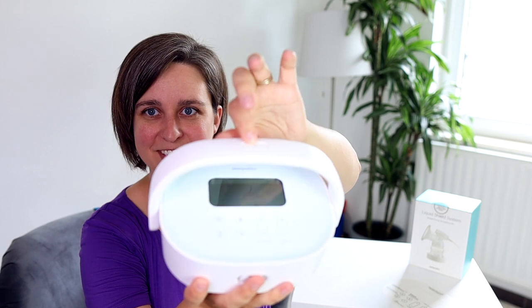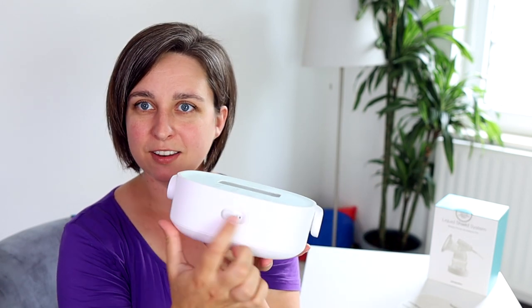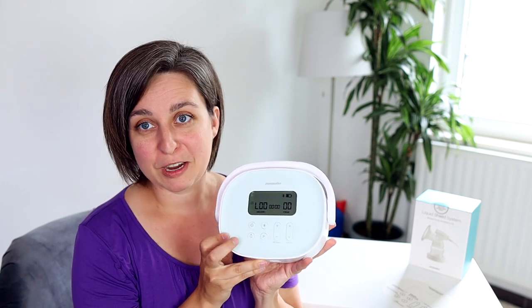It has three different modes. Here in the back, you've got the charging port and then you can double pump or single pump, of course, like all the other pumps. This one's already charged — let me show you how it works.